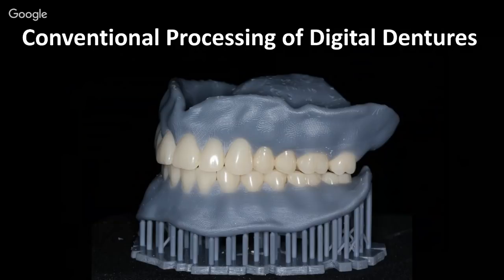And so same process. Let's just suppose, though, instead of doing it in the definitive pink base material, that you printed this in clear, or this happens to be gray, whatever shade. I think clear would probably be a good option because it's going to be cheaper than the denture base material, but it will still give a realistic appearance because the gums would shine through.